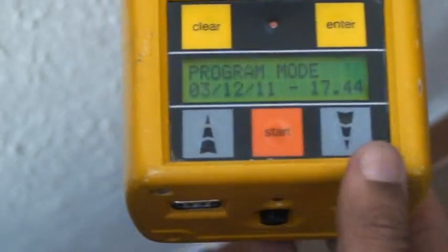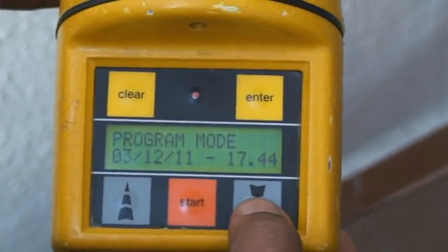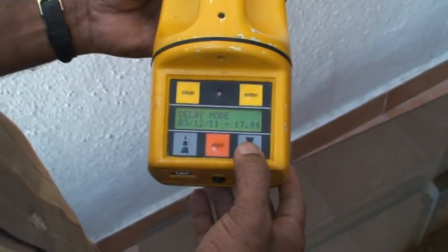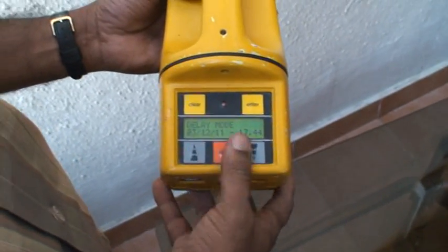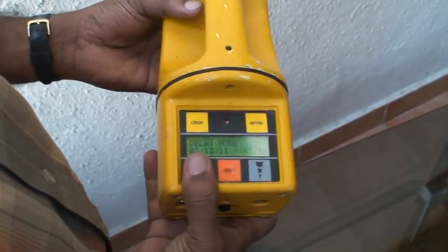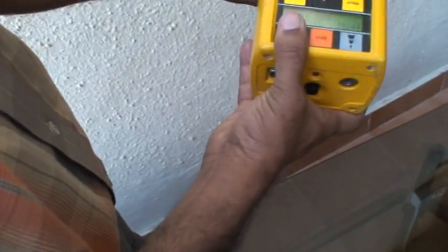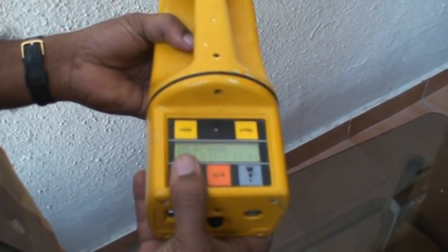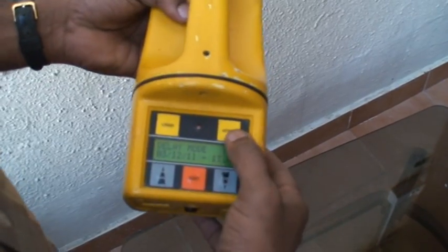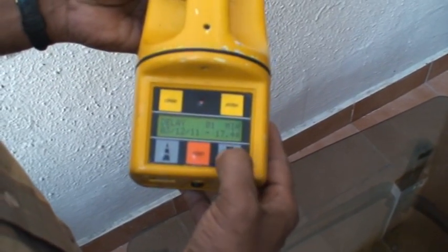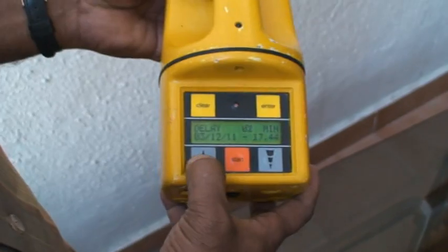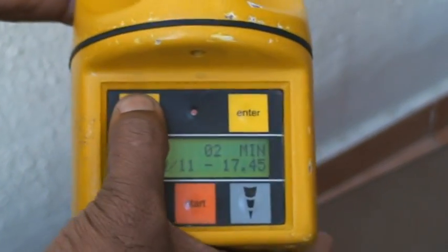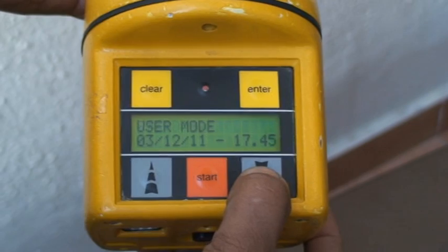You can set 1000 liters, 2000 liters, or whatever it may be, and save that in user mode. The delay mode is mainly applicable when placing the instrument in a clean room and you want it to start after a few minutes — for example, a five-minute delay. You enter the value and increase or decrease it using the keypads. Press 'clear' to exit the delay mode.